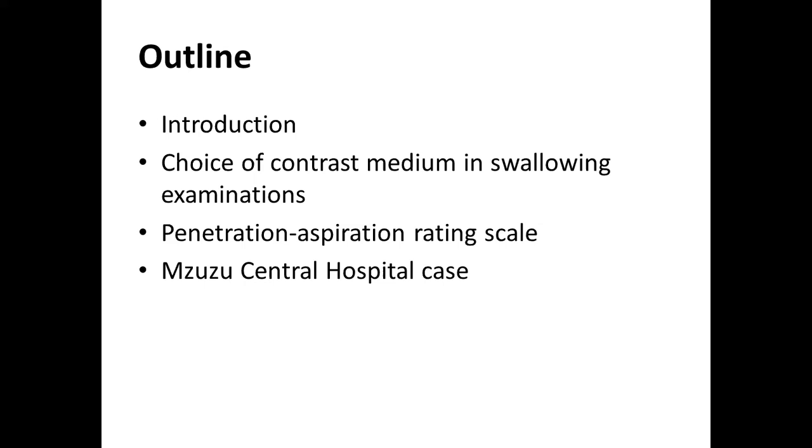scale which is used to help in communicating the degree of aspiration or penetration that has happened because of different reasons. This one helps us to communicate uniformly to our referring physicians on the degree of aspiration that we are dealing with. Finally, we are going to have a look at the case that we had at Mzuzu Central Hospital, where a patient aspirated contrast.